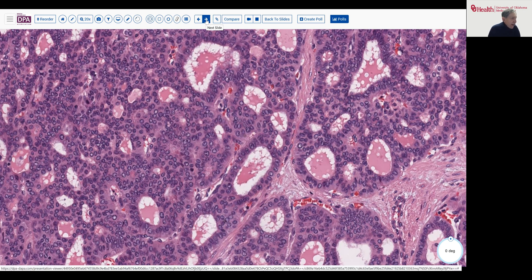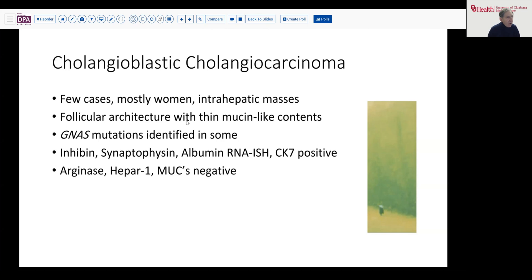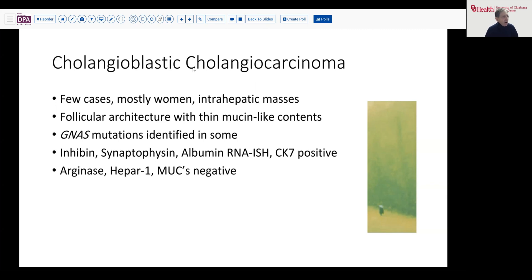In fact, that was done in this case. Without showing you the slide, it was clearly positive, indicating that this was a primary tumor originating in the liver. This pattern — large cyst-like spaces, pseudofollicular patterns — has been associated with the cholangioblastic variant of cholangiocarcinoma.